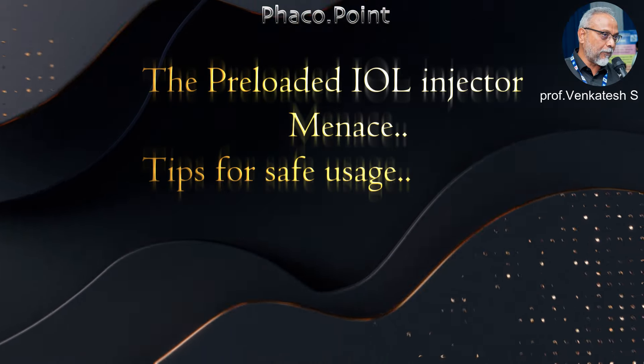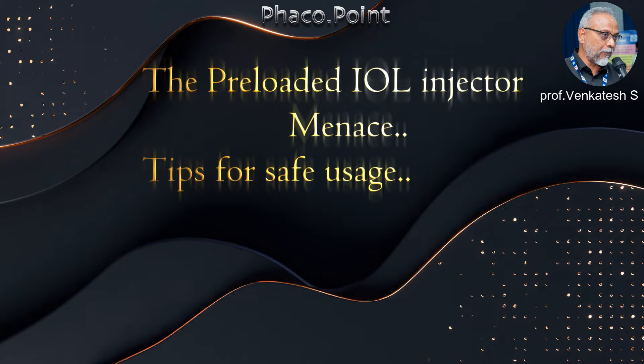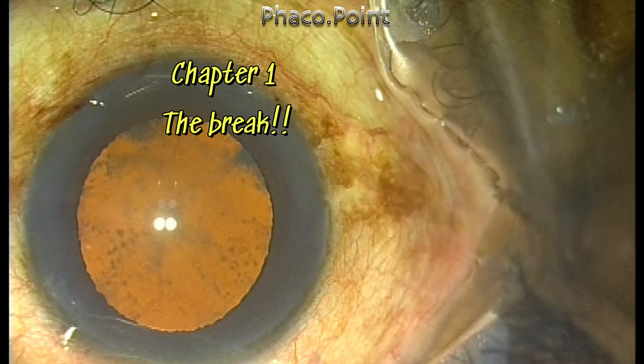Hello my dear friends. I recently started using the indigenous hydrophobic intraocular lenses that come pre-loaded, and I'd like to sound a word of caution while using these lenses. Let's take a look at the first case.